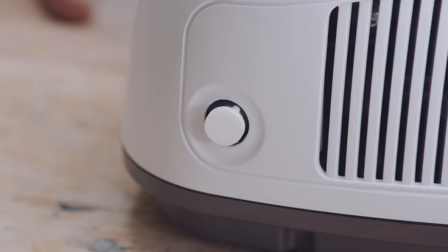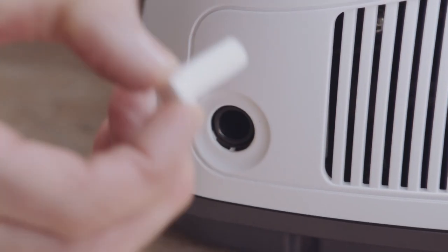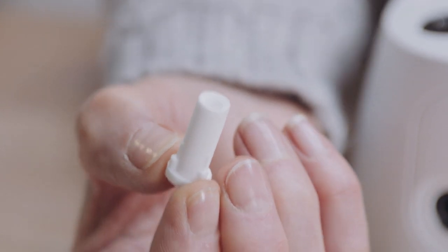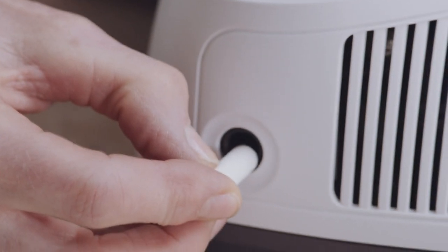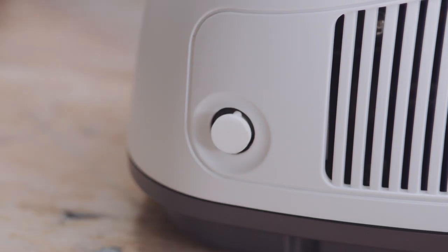The filter should be checked regularly and replaced when it becomes discoloured, dirty, clogged or wet. To change the filter, remove the white filter cap by gently pulling it out. When replacing the filter, make sure it's fully inserted. Don't wash or reuse the filter and don't use the unit without one.